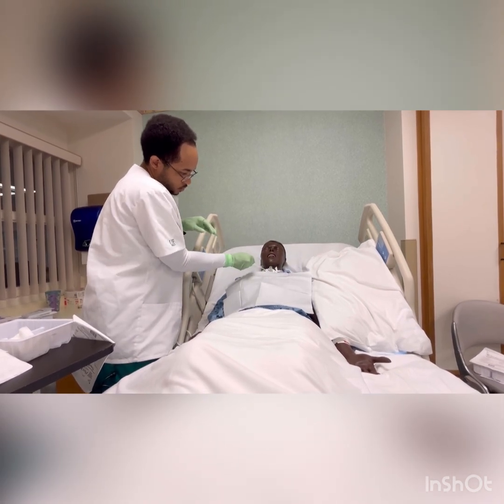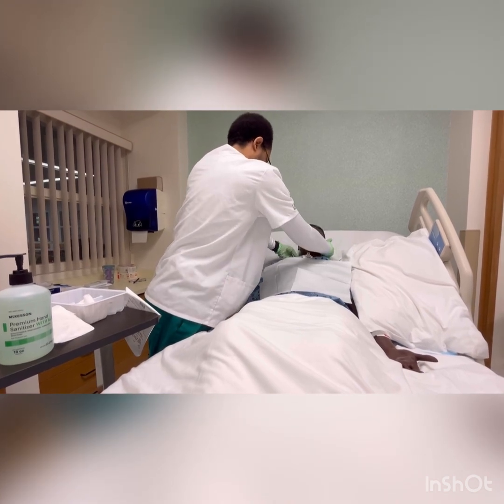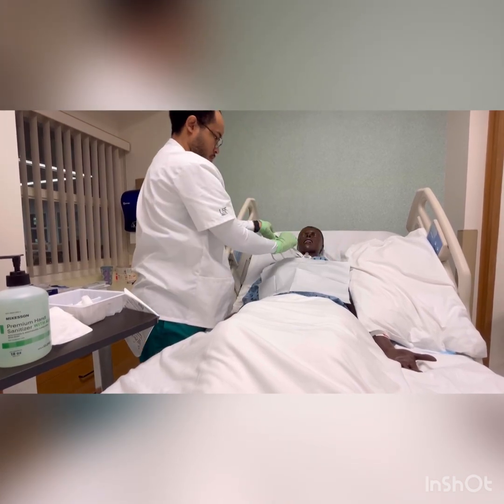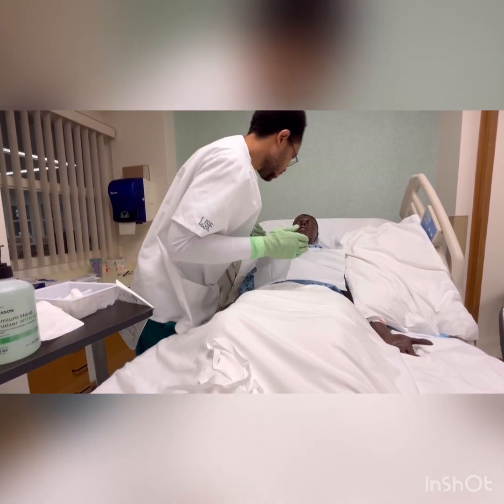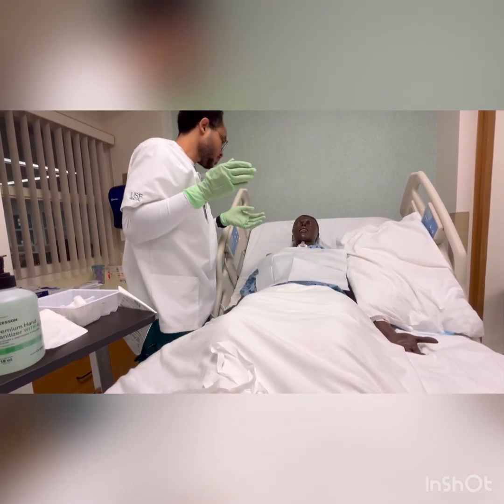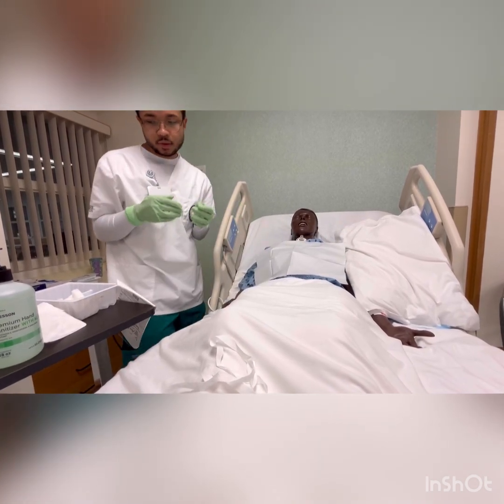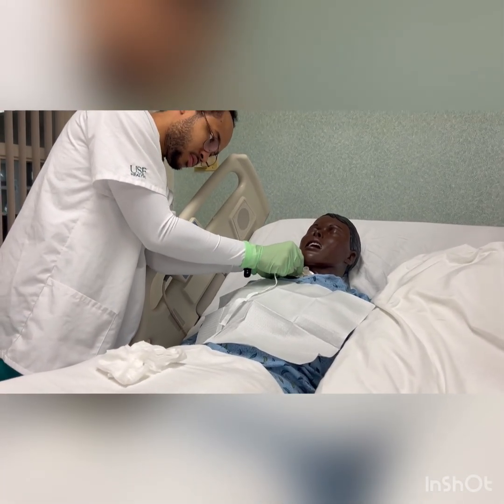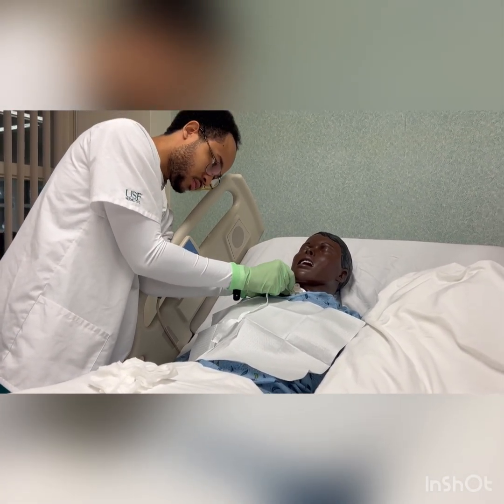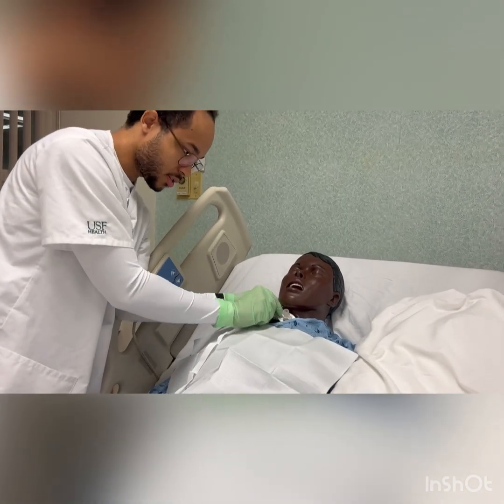You want to remove the old tube holder. And again, we want to assess the skin to make sure there's no damage, no skin breakdown, or no sign of infection, because we want to make sure that area doesn't get infected, making our patient worse off. After removing the old tube holder and assessing the area and skin, we want to change to a new tube holder and ensure the security of it.